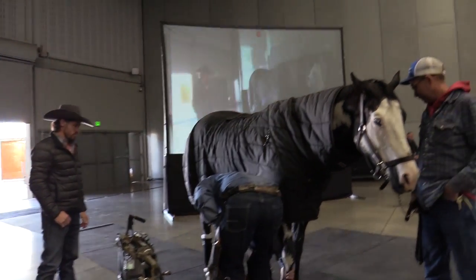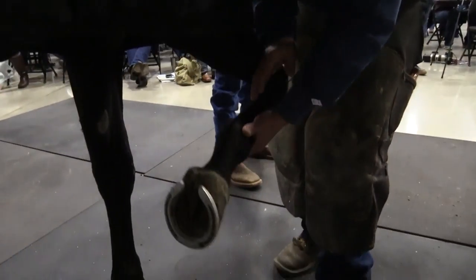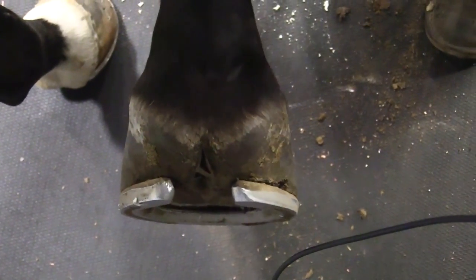You've got it right in front. Pull that up. This was the one that had lost some of her light there. Try to come right over the top here where you can see straight down like that. So when you sight down the leg, it actually looks pretty level. But radiographically, joint spacing still being a little compressed to me, I'd want to drop him just a skosh. That's good.